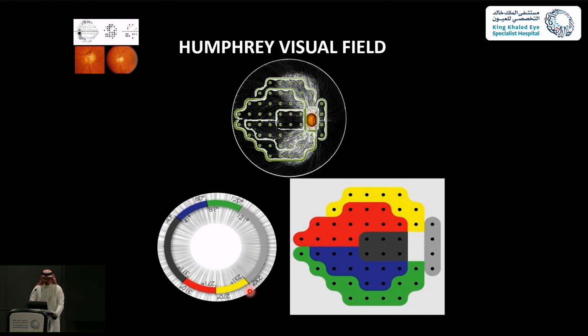For example, if the patient is having thinning in the red and yellow zone, the expected visual field change will be in these superior areas. If he's having thinning in the green zone, the corresponding visual field change will be in the inferior green zone, and so on.